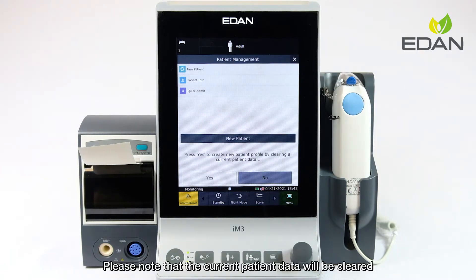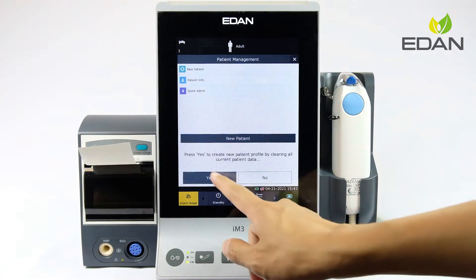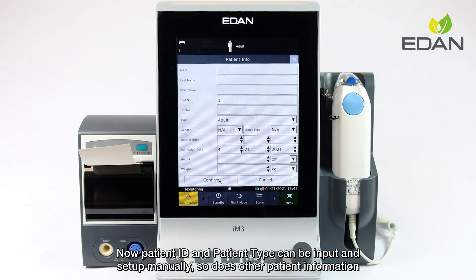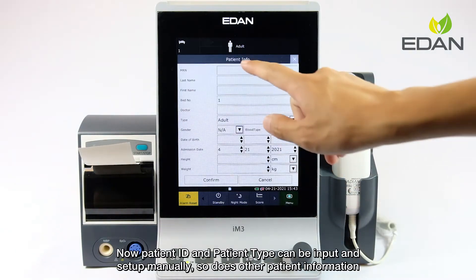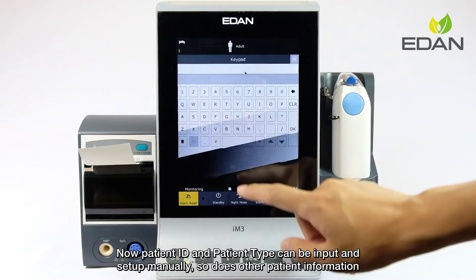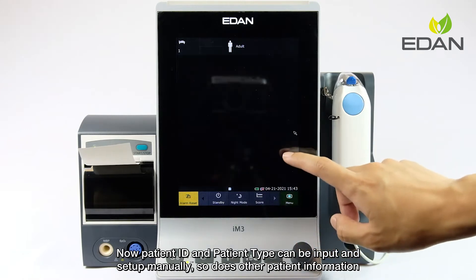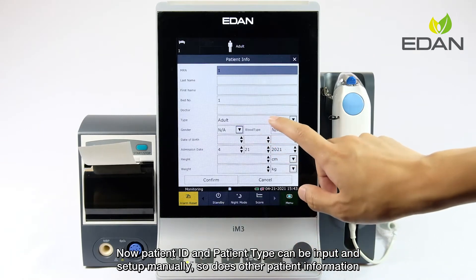Please note that the current patient data will be cleared. Patient ID and patient type can be input and set up manually, as can other patient information.